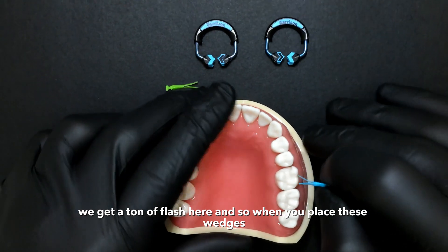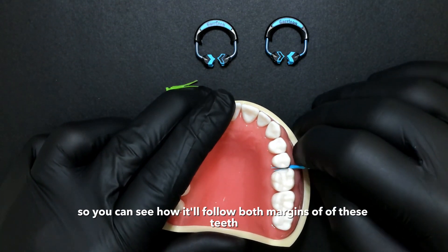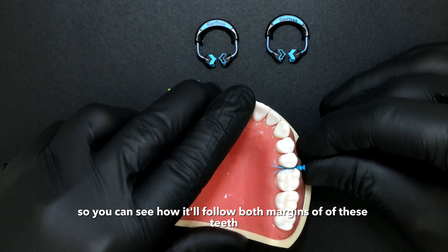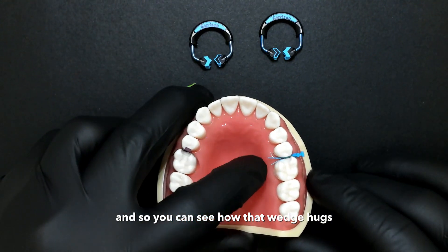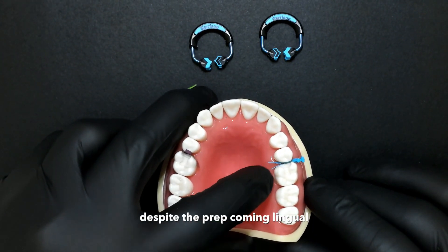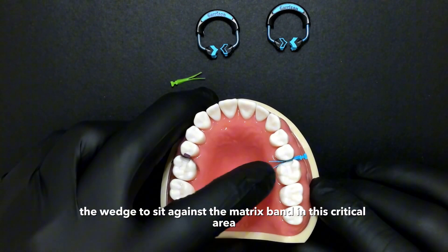When you place these wedges, I'm just going to place without a matrix band here so you can see how it'll follow both margins of these teeth. You can see how that wedge hugs the gingival margin of that prep despite the prep coming lingual, and it allows the wedge to sit against the matrix band in this critical area.